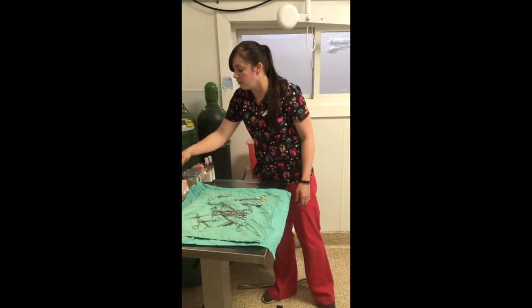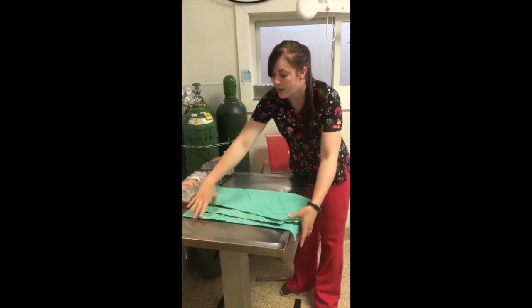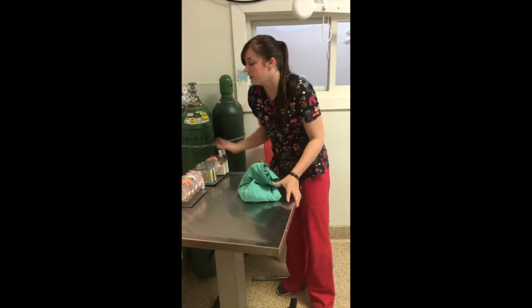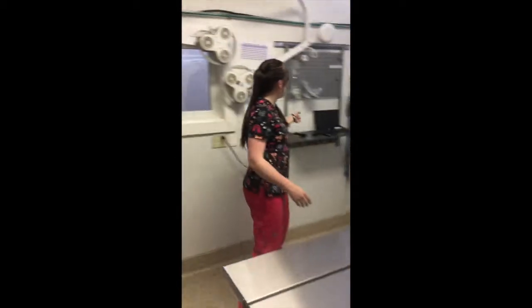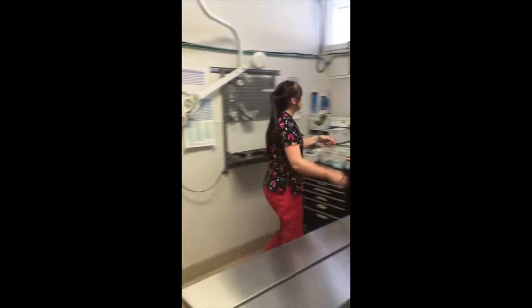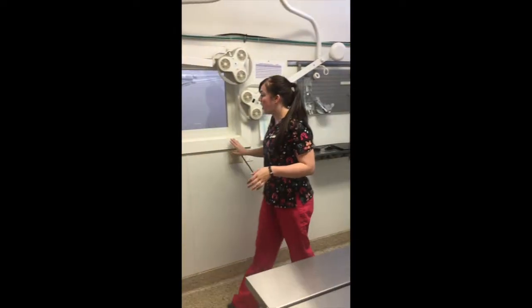We want to make sure that all of our sutures are closed. Our packs will get taken out to be cleaned and rewrapped. Everything is pushed away and organized. Our computer for our medical record, the anesthetic monitoring, is closed. Everything looks to be in order. There's no blood or grime on any of the walls.